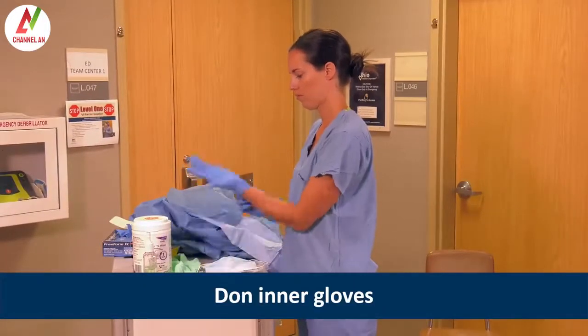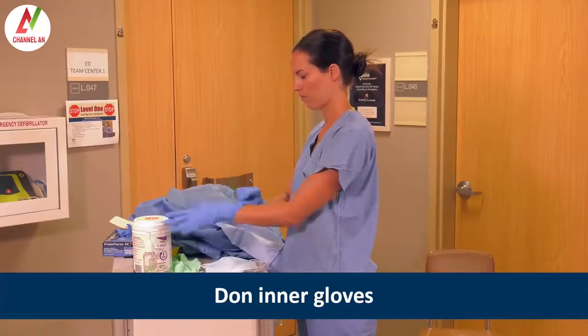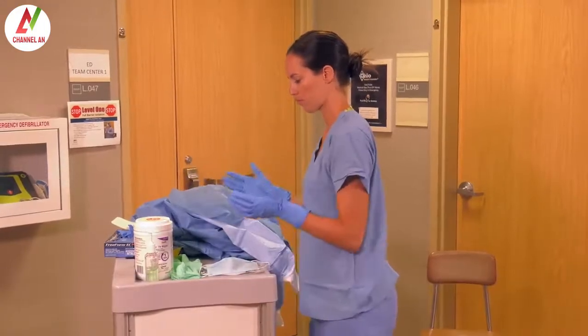If a respiratory HCID is suspected, she would put on a single pair of gloves later in the donning process.